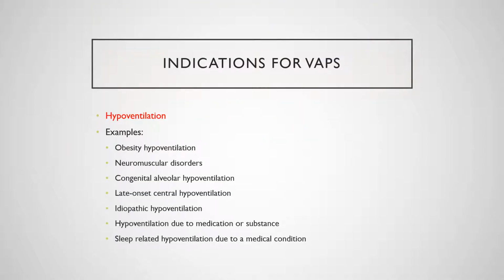The indication for VAPS is hypoventilation. And again, there's several different types of hypoventilation. Again, these are listed in your book.